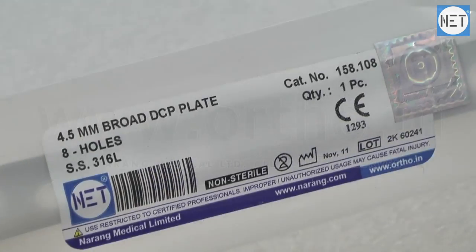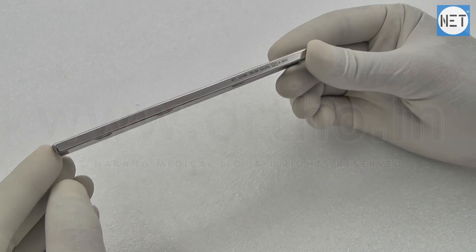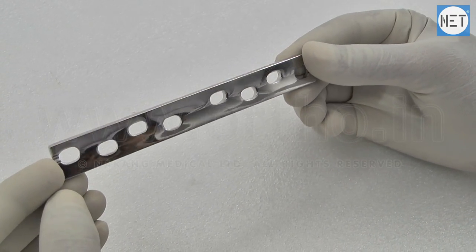Net Brand Broad Dynamic Compression Plate. These plates are indicated for fixation of various long bones such as humerus, femur, and tibia.